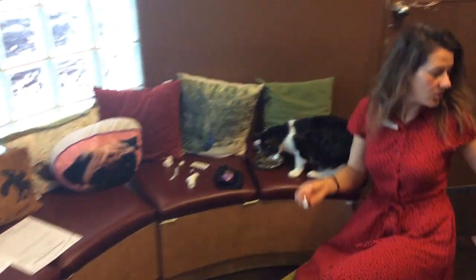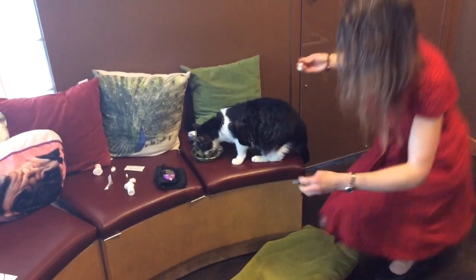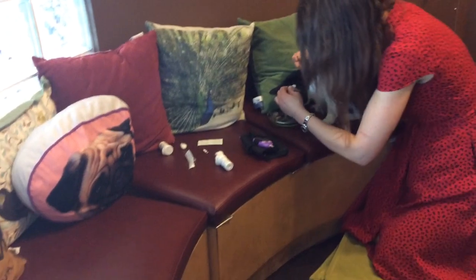I always like to feed a cat while he's getting this procedure done, so I'm just going to add some treats to his food to distract him, because usually I'll be feeding them their meal. This will often be done in the morning as well.